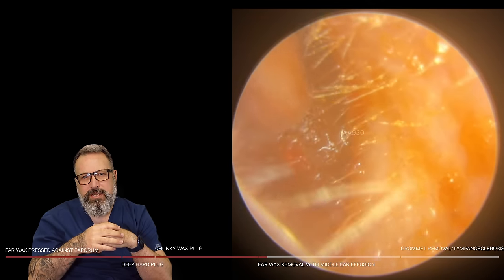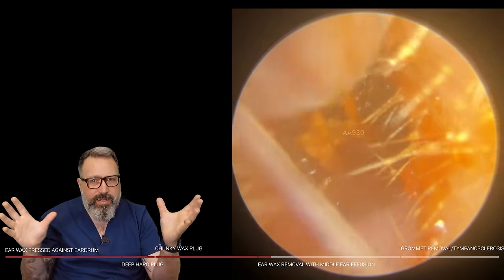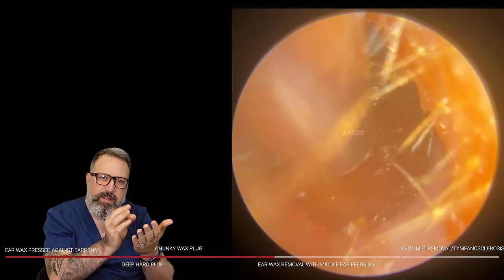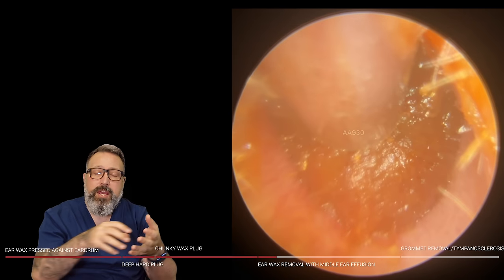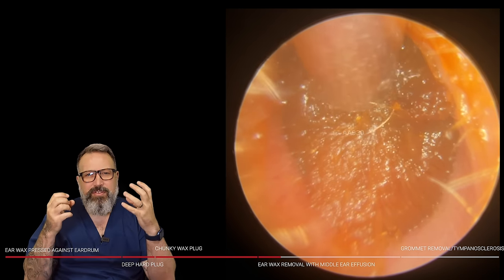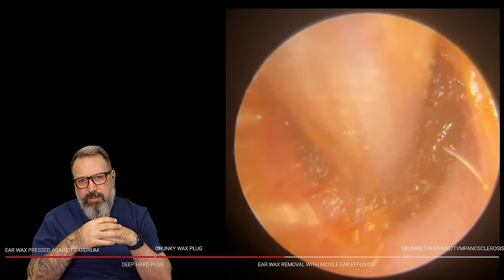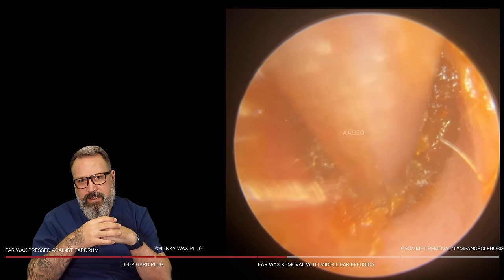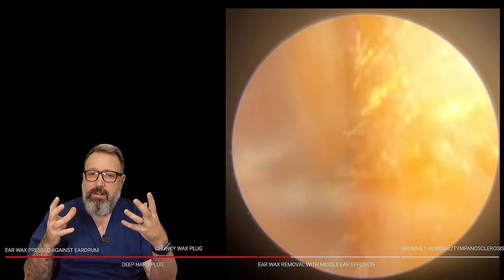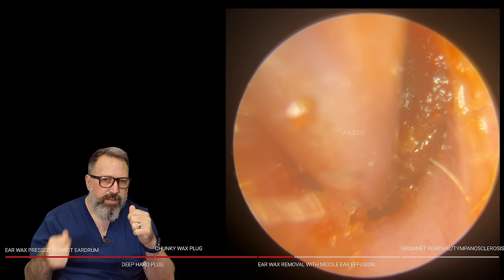We're constantly moving very slowly, moving the suction tube forwards, maintaining suction and contact with the wax so everything starts getting sucked inside that tube. You can see that consistency — it's a very thick, gloopy kind of wax. Trying a different portion of the canal — the difficulty with this consistency is it tends to line the inside of the suction tube and restricts the airflow, so you have to keep flushing it on a regular basis.